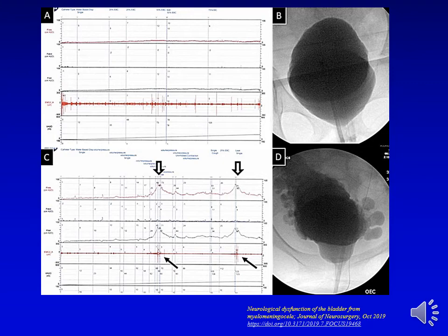Okay, these are video urodynamics showing the leak point pressure. This is actually a detrusor leak point pressure in a neurogenic bladder. As you can see in image D, that is a very trabeculated, thickened bladder seen in neurogenic cases, in this case a myelomeningocele, and this patient exerts very high pressure in the bladder before any leaking occurs. That means this pressure will be transmitted to the kidney. These patients can have hydronephrosis, or swelling of the kidney, which will result in renal insufficiency or kidney problems.